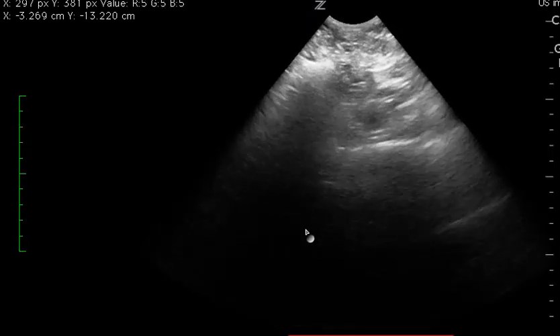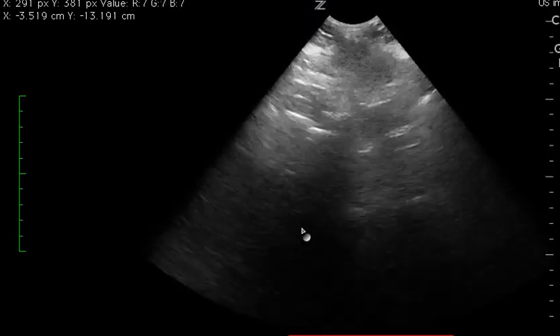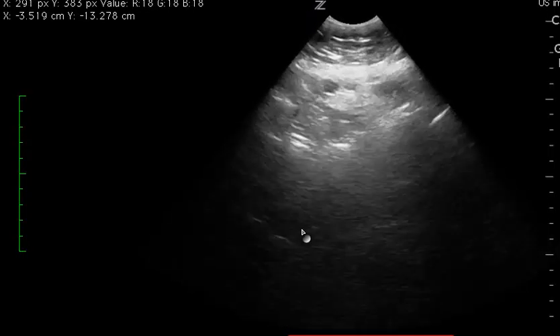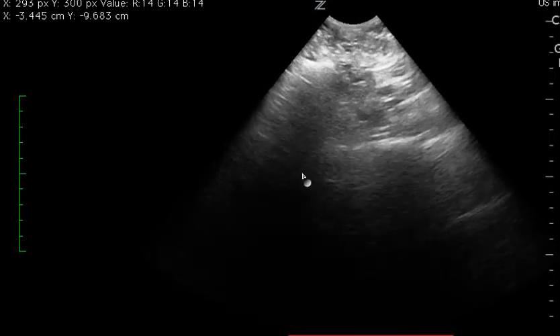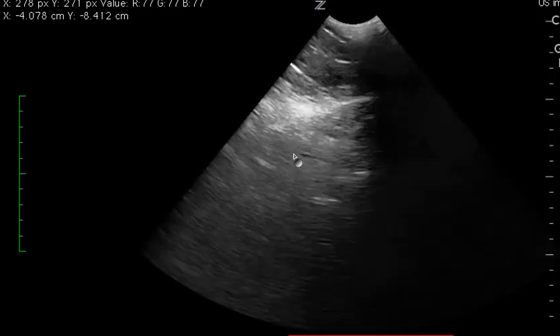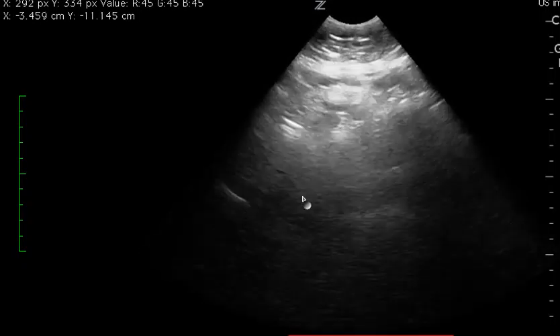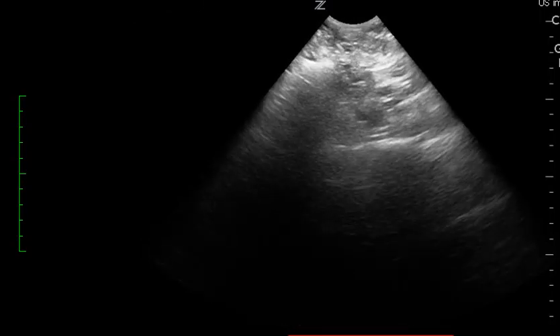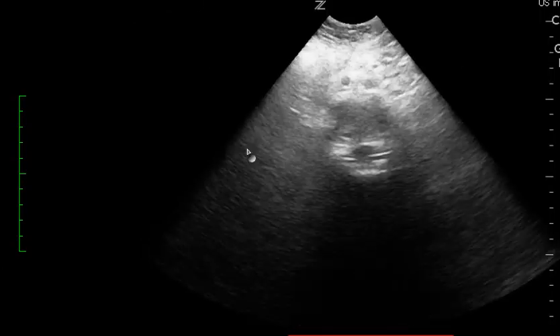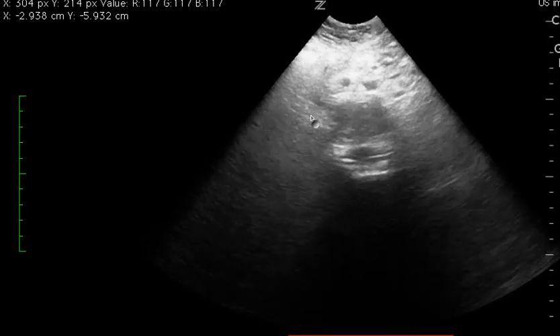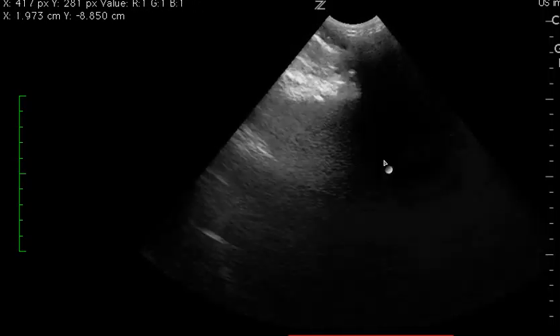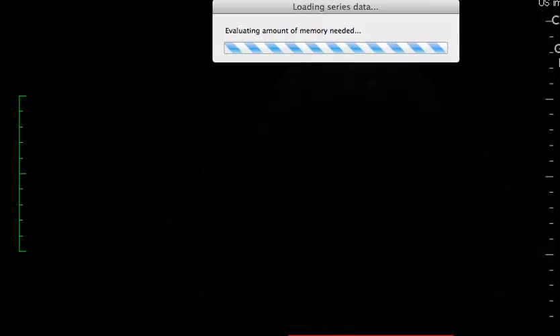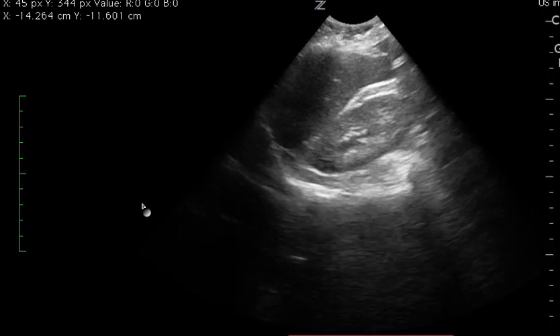As you go through some of your other images, you'll notice that the probe kind of leaves the patient's body. Watch here as you lose all this contact and your image kind of disappears, which makes it difficult to review. This happens on pretty much every single clip from here on out — I don't know if the patient's moving, if it's a difficult patient, or if there's no contact with the skin.